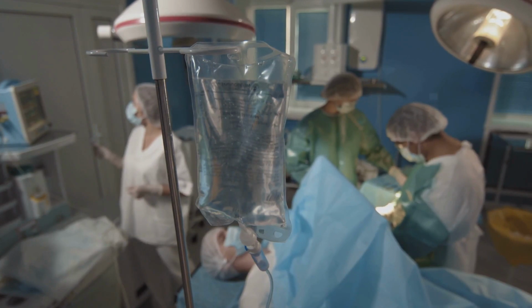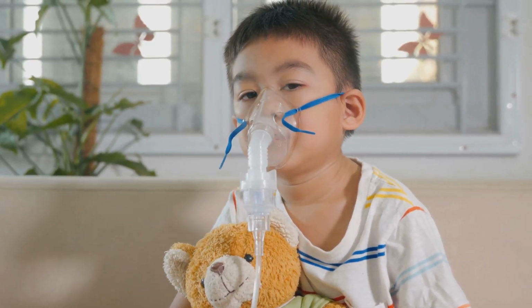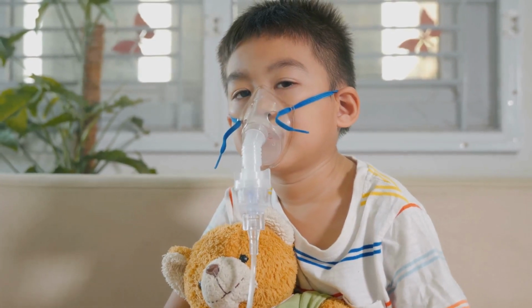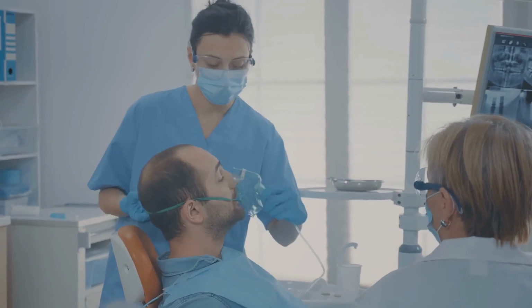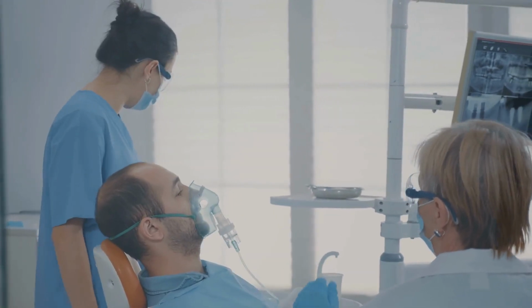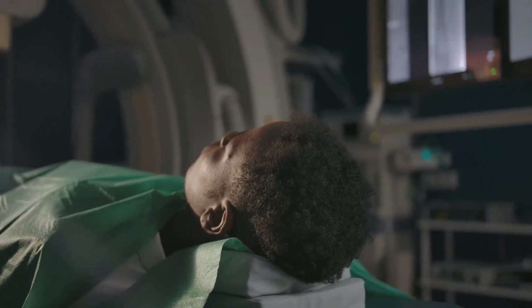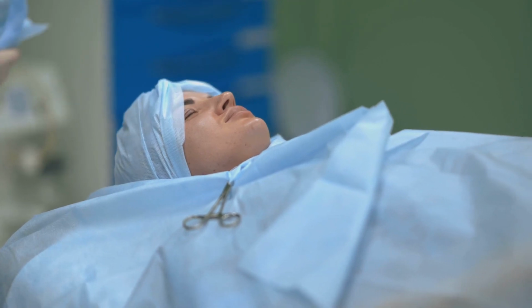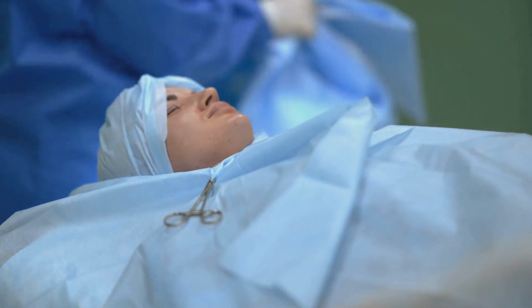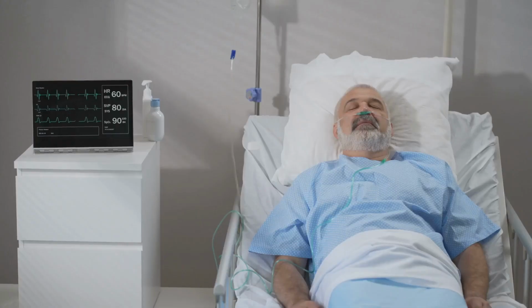Topicalization, the application of a local anesthetic, is next in line. This numbs the airway, making the procedure more comfortable for the patient. Our discussion led us through 3 different techniques for topicalization: the nebulizer, popsicle stick, and viscous spray. Each has its own merits and suitability depending on the situation. Nerve blocks may also be used to further enhance anesthesia. Sedation follows, but it's a delicate dance. It's crucial to achieve the right balance to maintain the patient's cooperation while ensuring their comfort. Finally, we have the intubation itself, a step-by-step process that requires skill, patience, and precision.